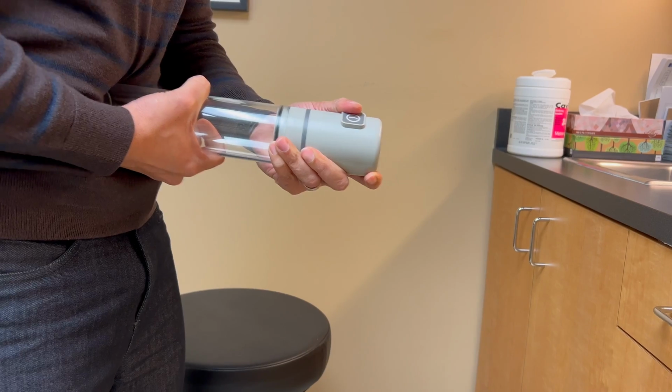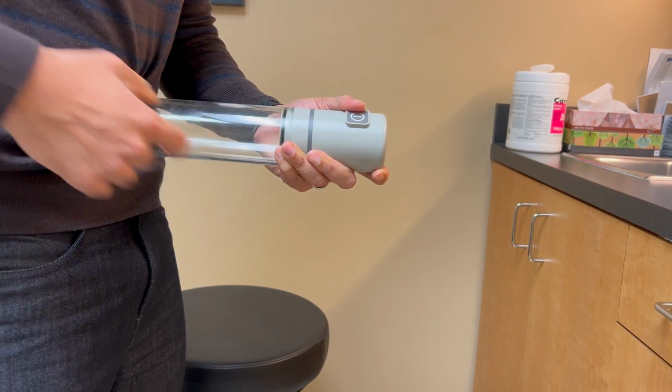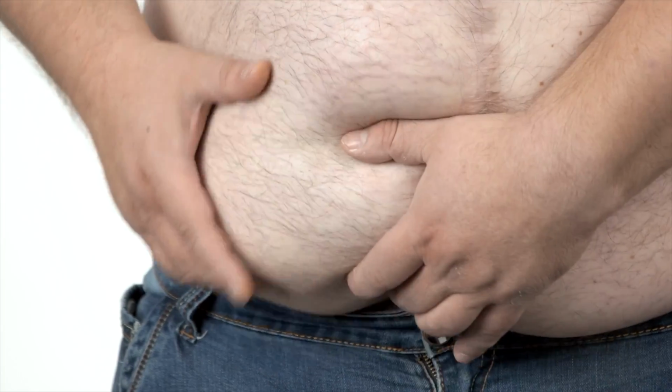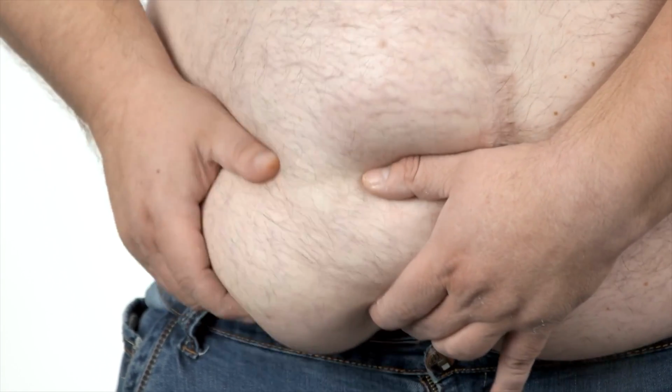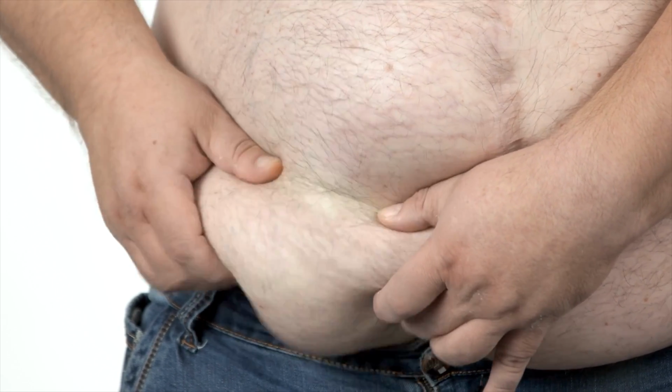Let me explain. First, when you use a vacuum pump, you are creating pressure with the pump on your skin and pressing down to your pubic bone. This pushes the skin and your fat against the pubic bone, which gives the impression of a longer penis. Pressing against the bone with a vacuum pump will allow the penis to get exposed more. However, when you cycle your implant, the skin and the fat will still be there, covering part of your implant. The skin and fat that is on top of your pubic bone are still covering part of your penis, which will give the appearance of a shorter penis.